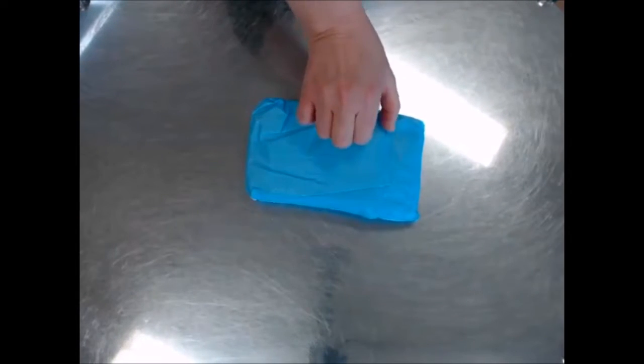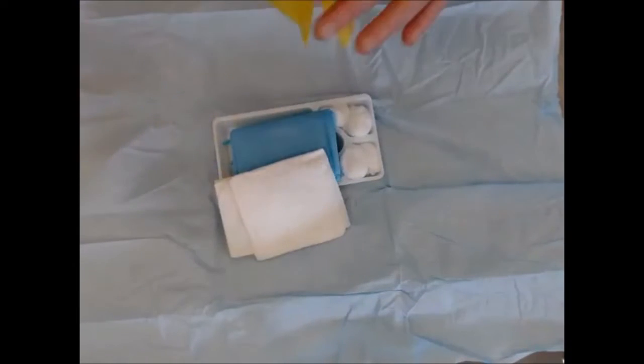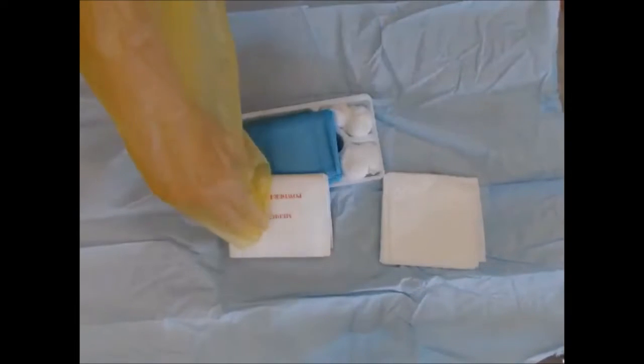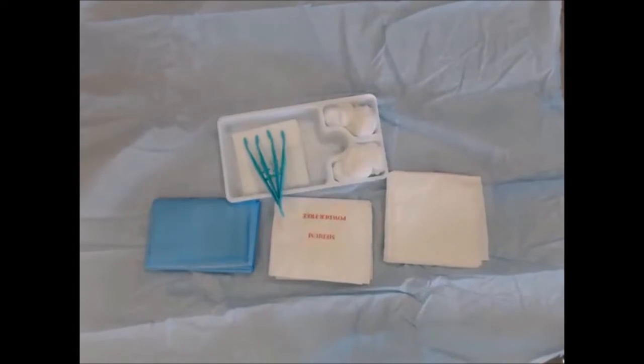Open the pack and place it onto the center of your trolley, then by touching only the corners of the pack, open it out carefully. Don't touch anything in the center because that's your sterile field. In the catheter pack there is a disposal bag — reach in and take out the yellow bag. You can put your hand into that and rearrange everything in your sterile pack: wipes, gloves, a fenestrator drape, plastic forceps, cotton balls, and gauze squares. Place the yellow bag at the edge of your trolley to use for waste.